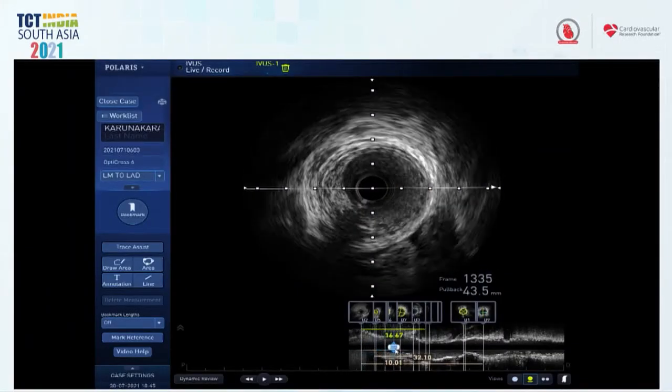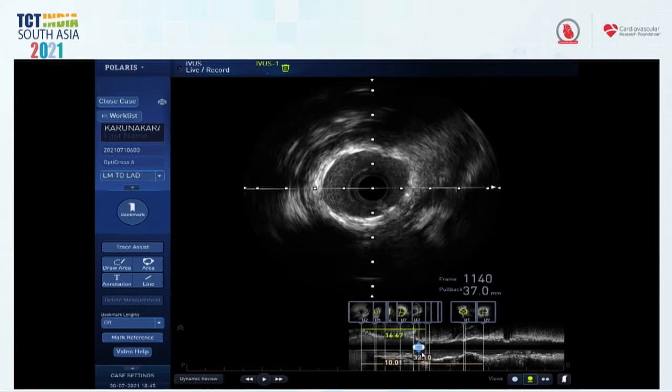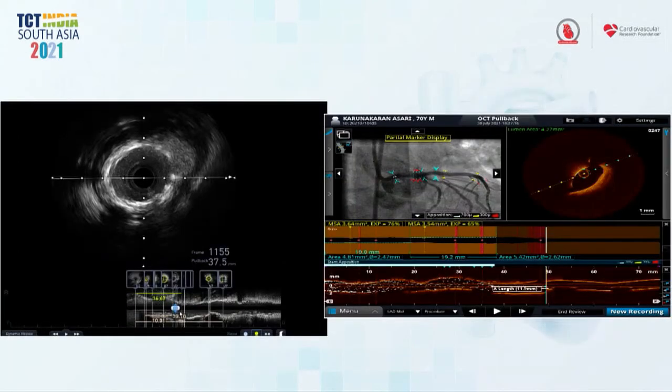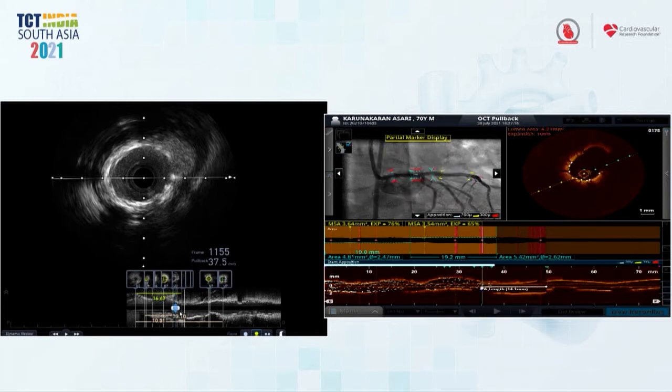So I will show you why. Let's show the OCT first and show you the length. Can we have the OCT pictures first? Here we are at the OCT, trying to measure. Move one more frame proximally. So that's the stent. You have to go to the frame where the LCX starts distally. Come back a frame, when it gets rounder. That point you mark as the distal, and come back proximally.